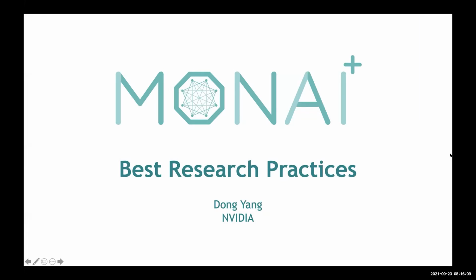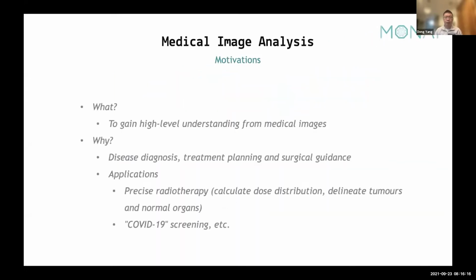Okay, perfect. So today I'm going to talk about the best research practice with MONAI, and let's dive into it. Just a few sentences to introduce medical image analysis. It just means to gain a high-level understanding from the images. The applications could be disease diagnosis, treatment planning, and surgical guidance. We use it for several purposes, like precise radiotherapy, or even recently we applied it for COVID screening.